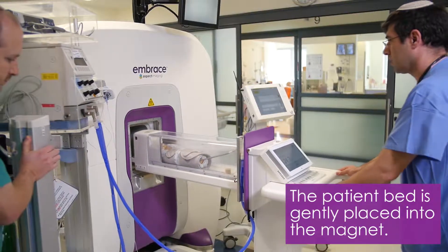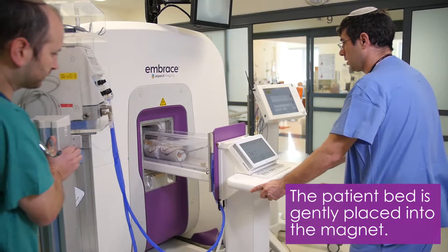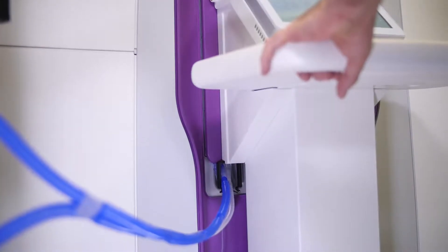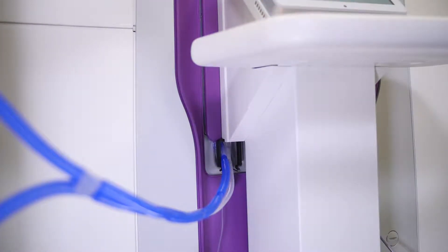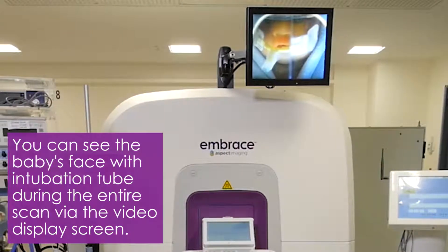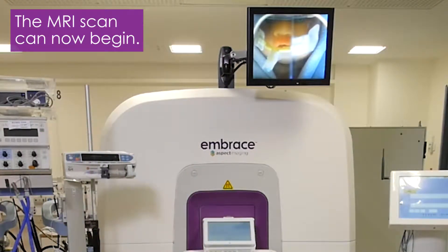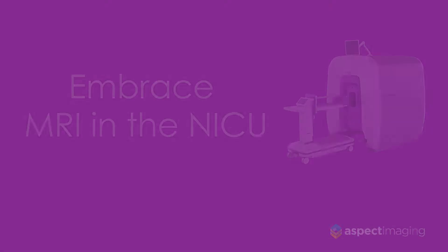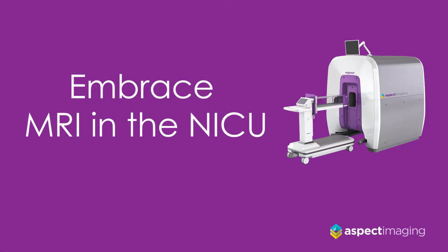Roll the neonatal capsule smoothly into the magnet until it is fully locked into place. Now the scan can begin. You can see the baby's face during the entire scan via the video display screen.